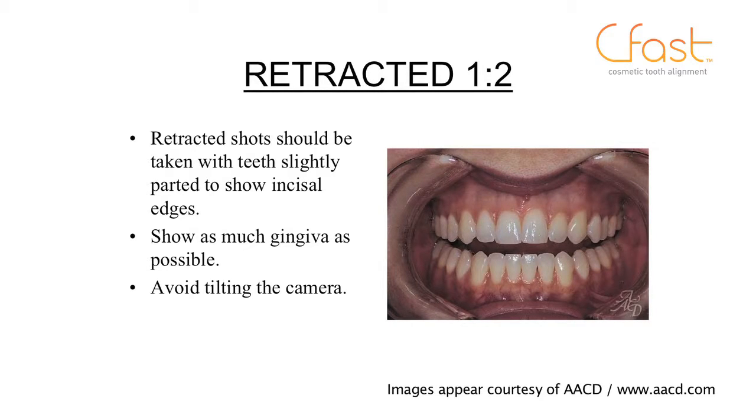Either have your assistant hold them, and we'll demonstrate there's a little way that we can rotate and insert them, and then we want to be taking the lips completely apart because we want our retracted views. And these are still 1 to 2 views.